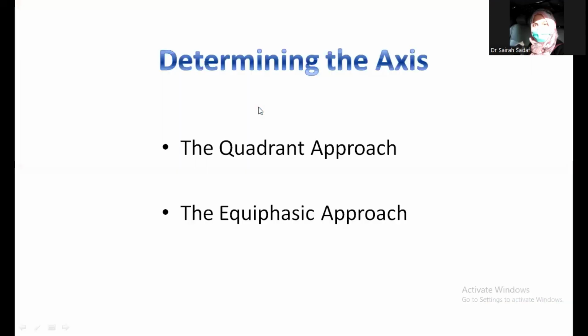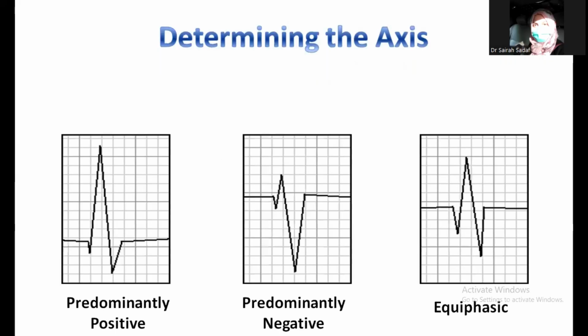Now, how to determine the axis? This is a bit complex idea. I want your full attention, full focus on the screen. There are two methods, but I will go for the quadrant approach because this is my favorite one and the easiest one. So let's see how we do this.